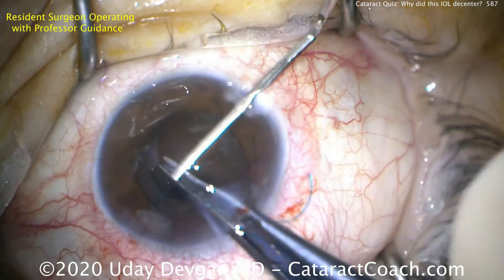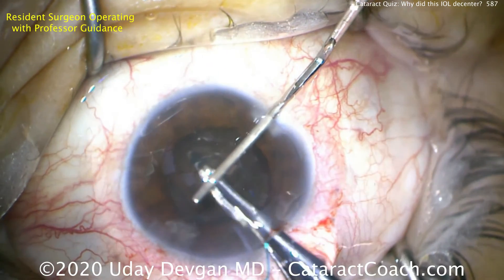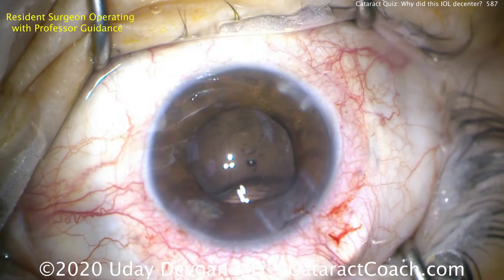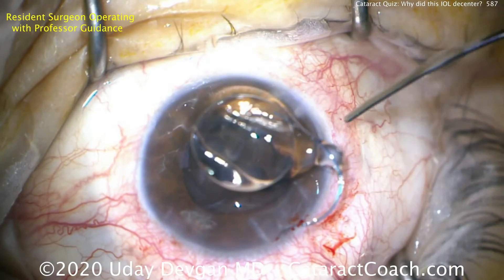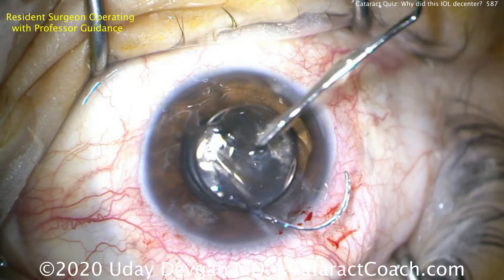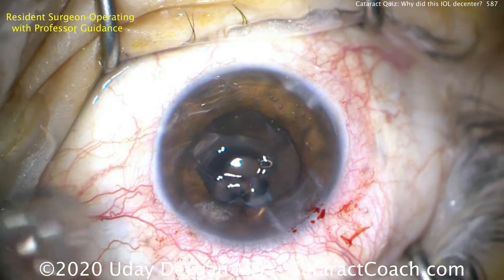Now we're going to do our twist technique. Spatula there to protect the cornea. And you twist the forceps, rotate about 360 degrees, and pull out of the eye — there's the whole lens. Lens comes out nicely. You can twist the tying forceps between your fingers to achieve that full rotation, or you can start off very supinated and then move your hand to pronated in this technique. And there's the lens.